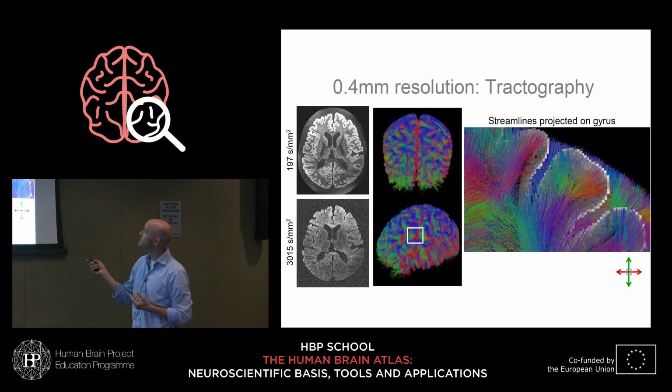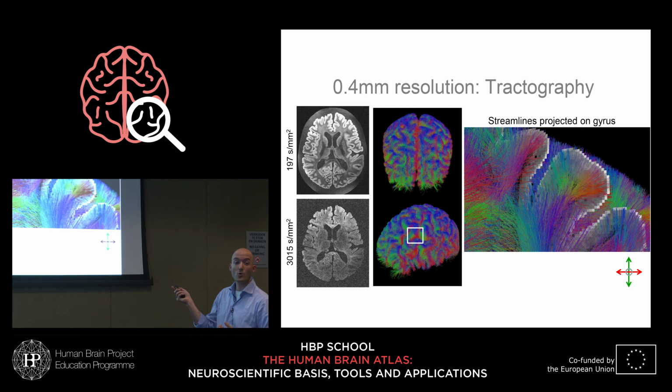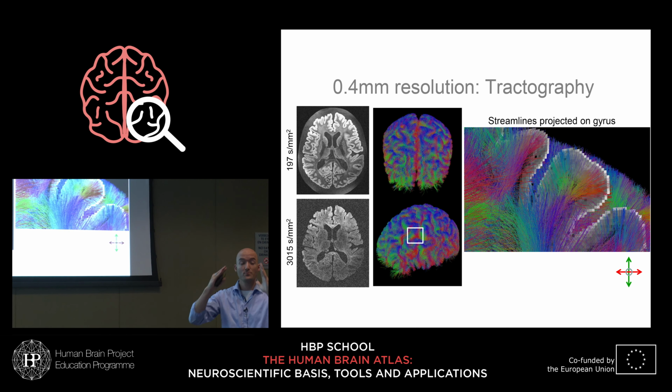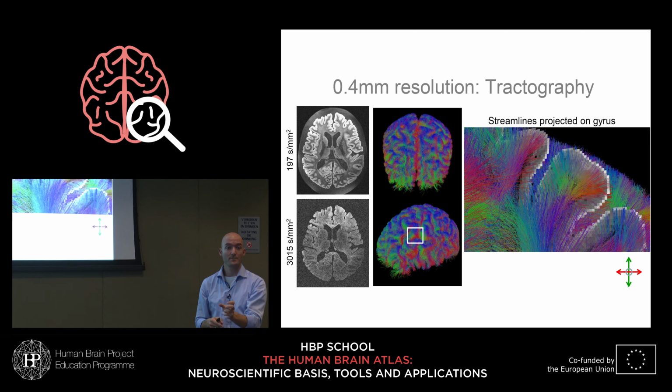So if you think about the cytoarchitectonics of this column of cortex here, and now let's focus on the layer 3 pyramidal cells, you'll know that here's the pyramidal cell. Here are its axons, right? And here's its apical dendrite extending all the way up to layer 1. Those dendrites also tend to form dendritic bundles, and the axons tend to bundle up. Diffusion MRI can't see the difference between a dendritic bundle and an axonal bundle, right?